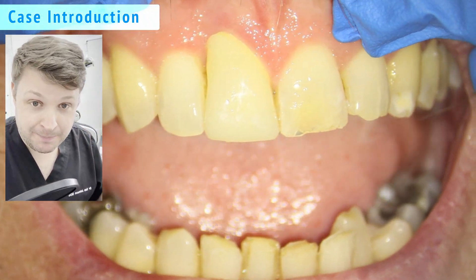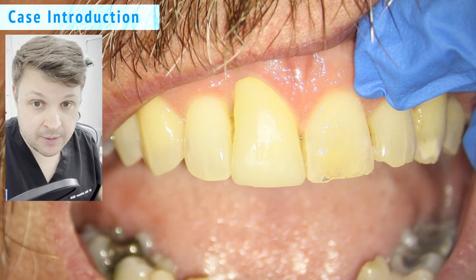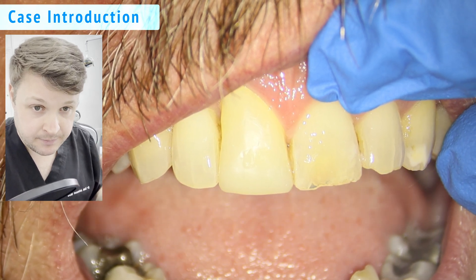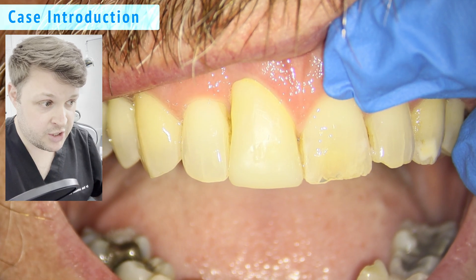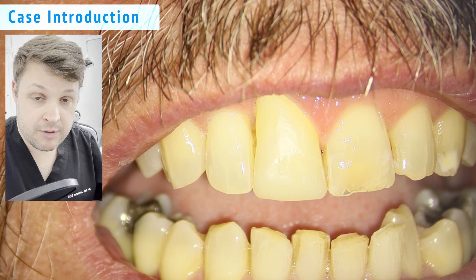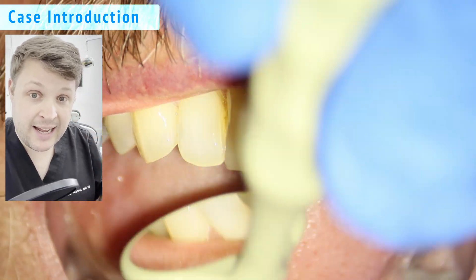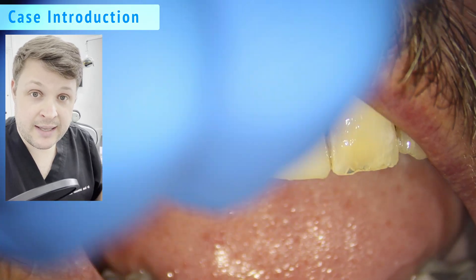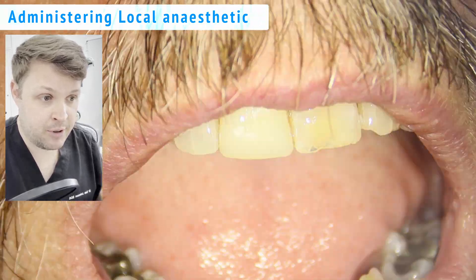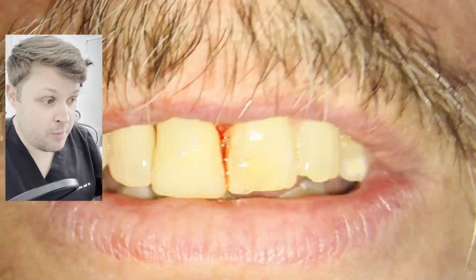Hello and welcome. This is a video demonstrating how to cement a zirconia crown. Regarding this particular case, you'll notice that the gingival margin of the crown we're going to place on the upper right one is quite high. If this patient had a high lip line that would be pretty obvious, but luckily it's quite low. During the consenting process the patient has been made aware of that and is happy to proceed.